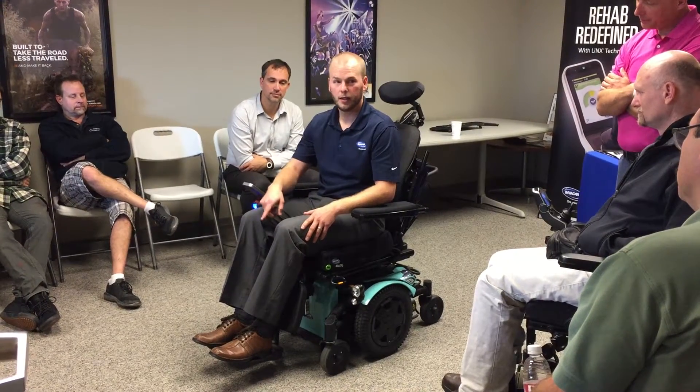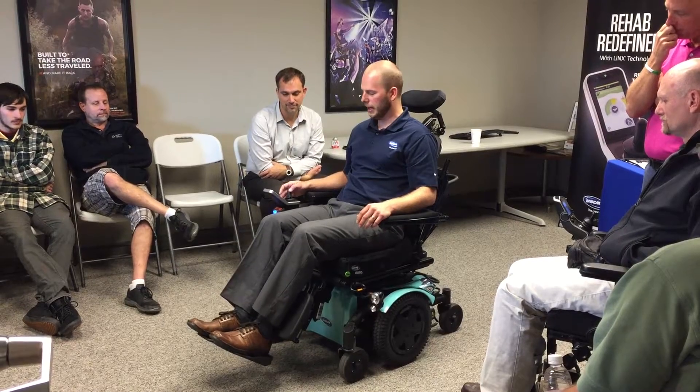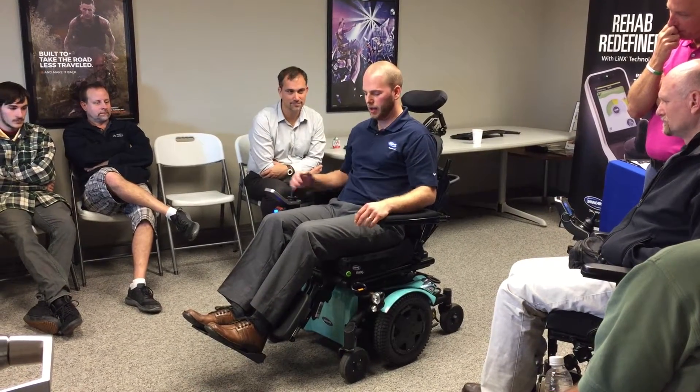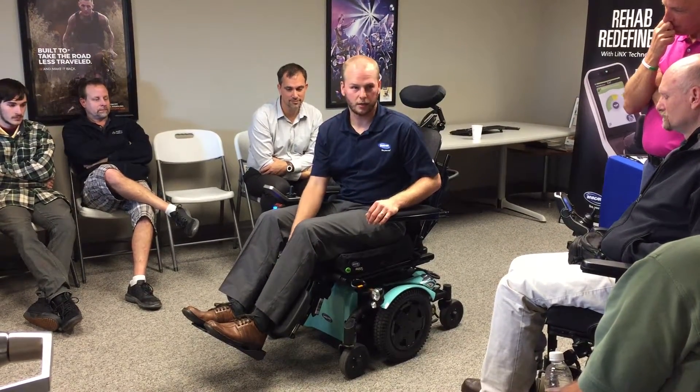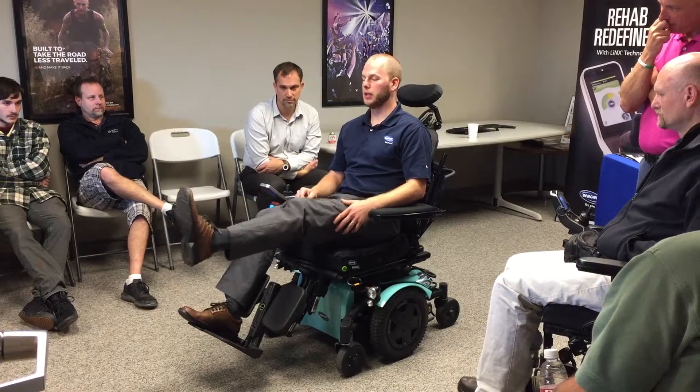There are two actuators: one that allows it to elevate and one that allows it to articulate. What they would do is elevate their feet. My seat depth isn't right here, but what would happen is it would bring their knees up real high, and then once they got all the way up, it would extend.